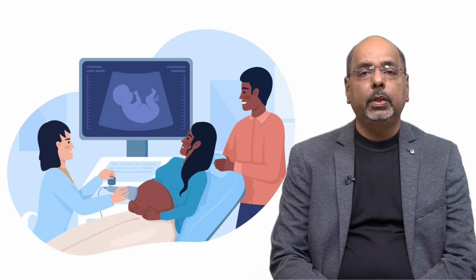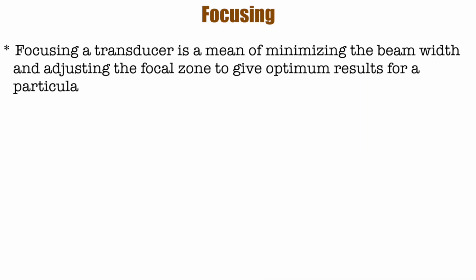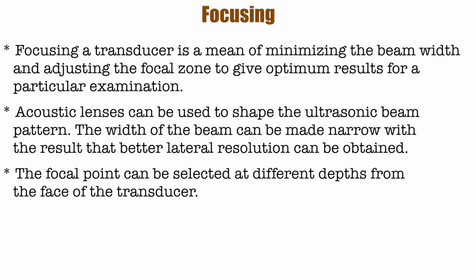Now we are going to see the effect of focus on the performance of ultrasound imaging. Focusing a transducer is a means of minimizing the beam width and adjusting the focal zone to give optimum results for a particular examination.